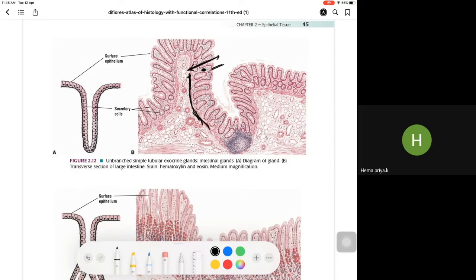And what is this portion? This is the submucosal portion, sir. Very good. And what is this portion? Sir, muscularis propria, sir. Super. Okay. So that understanding is very important: mucosa, submucosa, muscularis propria. Now you can see only the submucosa is having bigger blood vessels, isn't it? That's why the tumor cells have to cross the muscularis mucosa before calling it carcinoma.